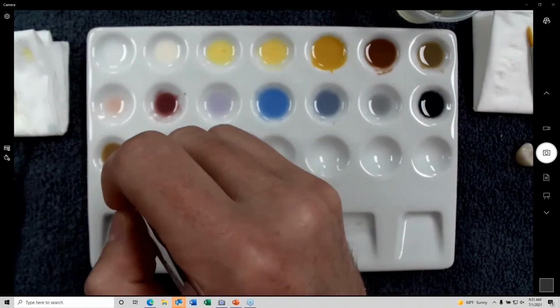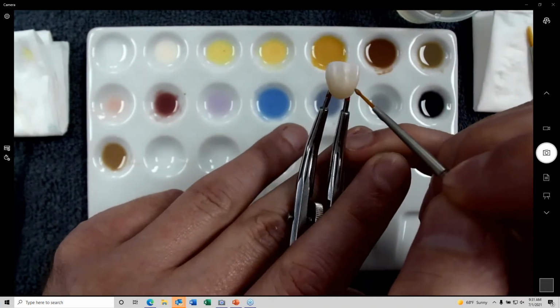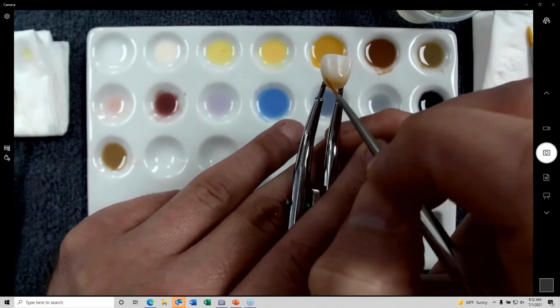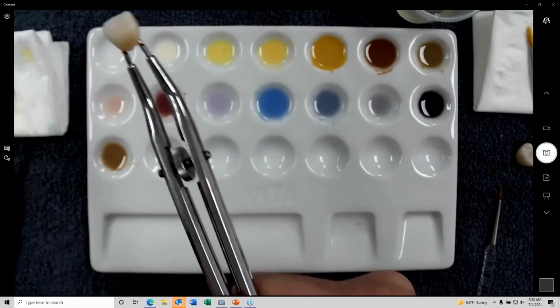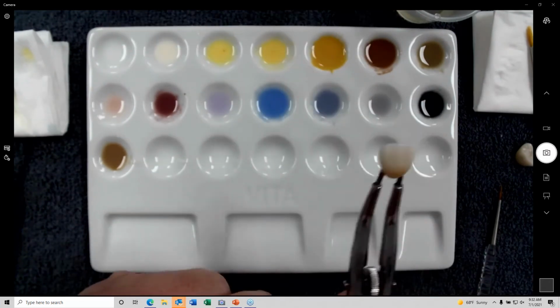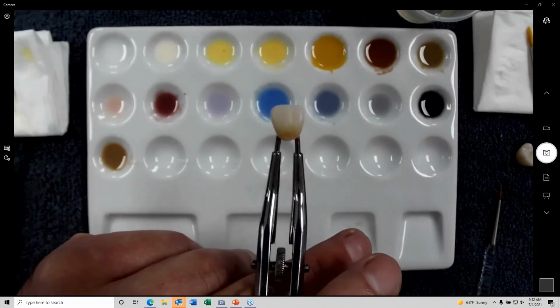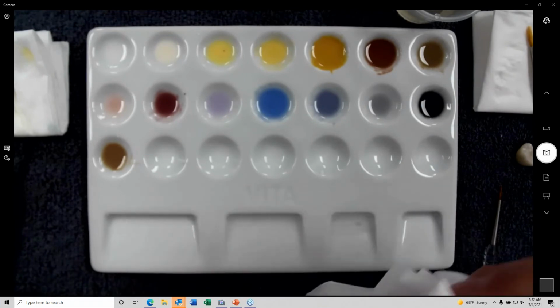And so what you can do, and this may take a little bit of practice to make sure that you get it just right, is to add a little bit of chroma or whatever, and then just hold it under the muffle just enough to dry it out. And then, if you're very delicate, you can add the spray glaze.